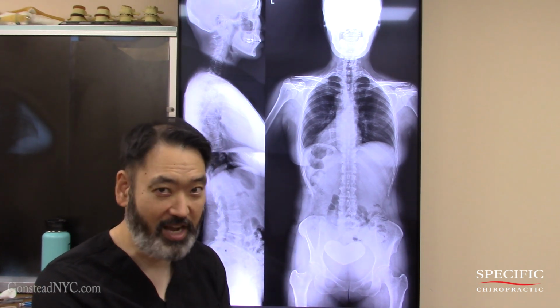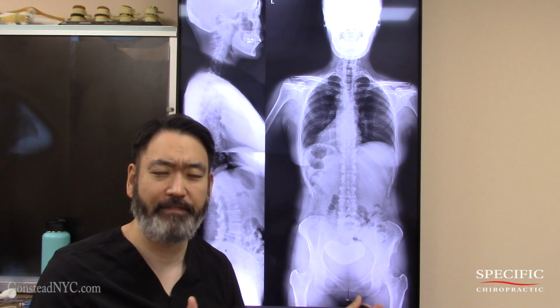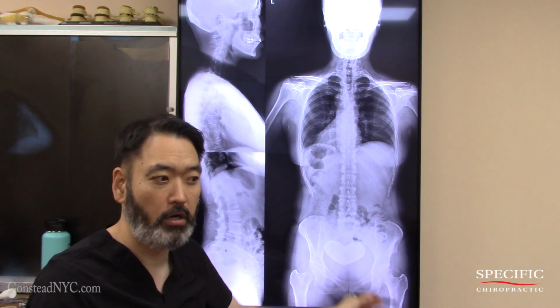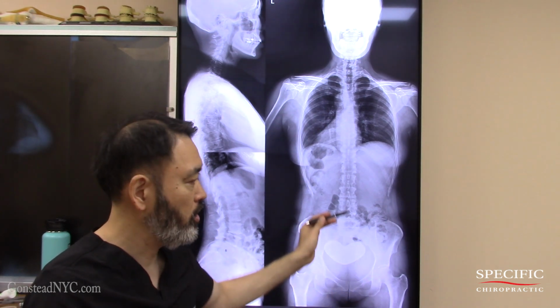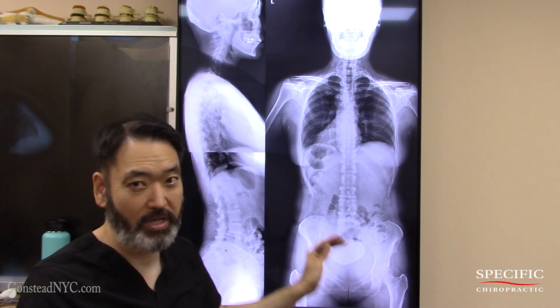The patient is not going to like that. So now I'm going to investigate, okay, do we actually have an anatomically, structurally short leg on the right side? So we do a gait analysis. You can also measure things. The most accurate way is we take the X-ray from the ilium all the way down to the feet, okay? You can measure that way.